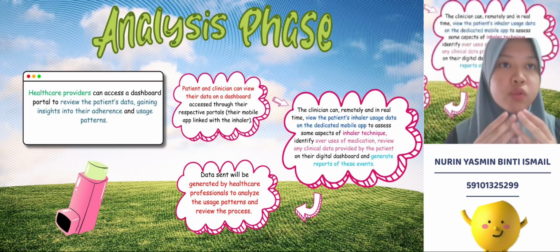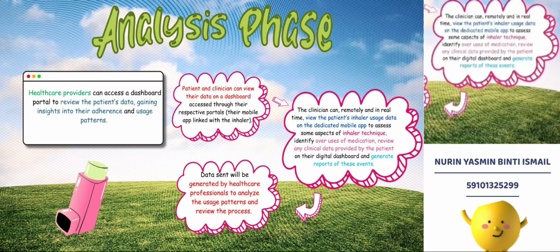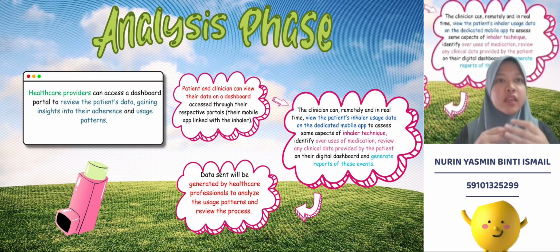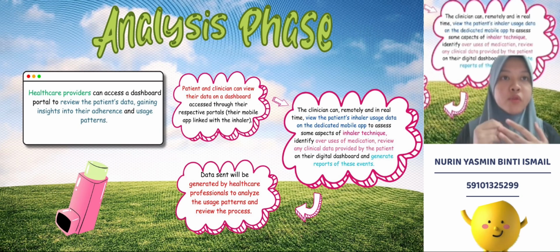The clinician can view the patient's inhaler data on the dedicated mobile app to assess some aspects of inhaler technique, to make it more convenient for the patients. Through the mobile app linked with the inhaler, the clinician can view the patient's inhaler data to assess some aspects of inhaler technique.